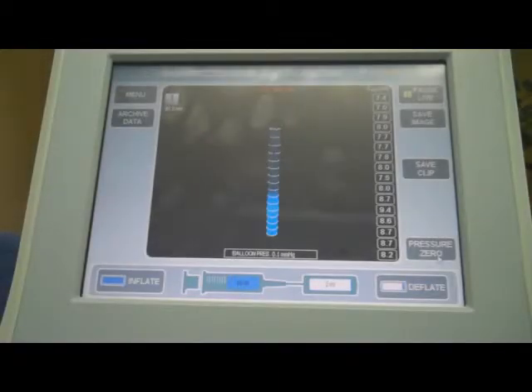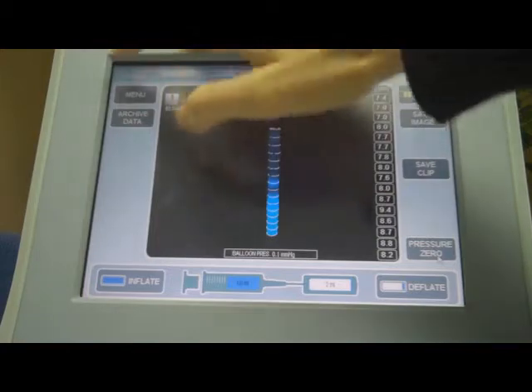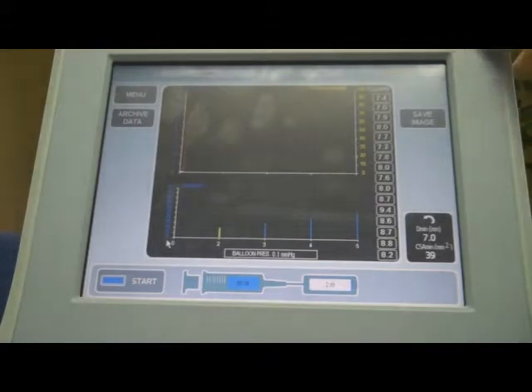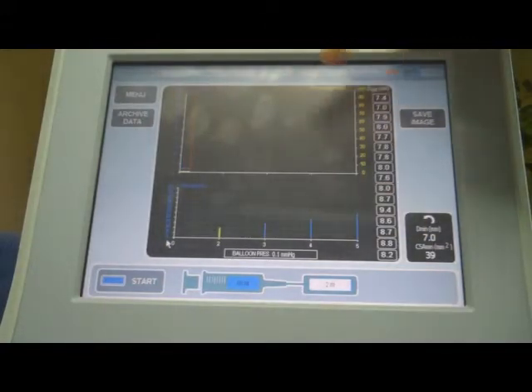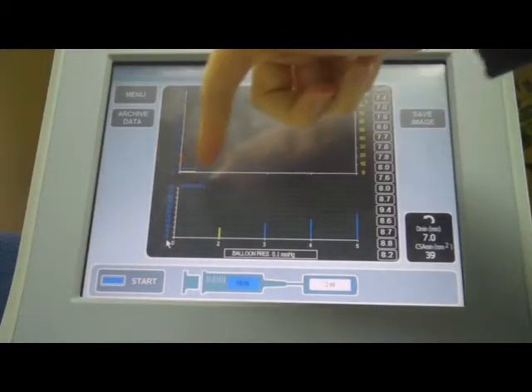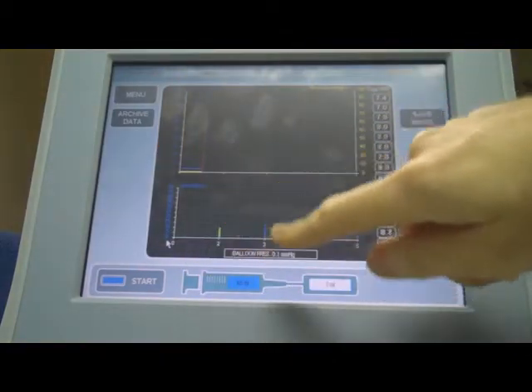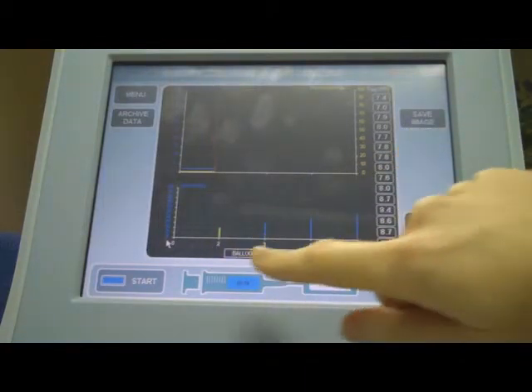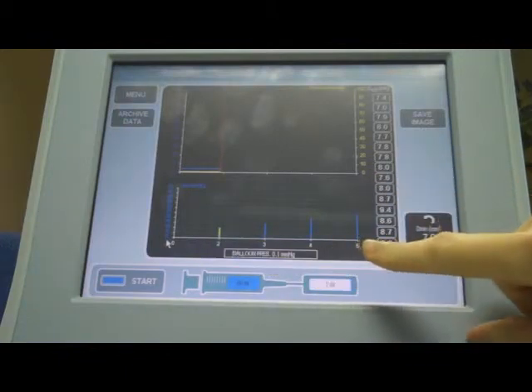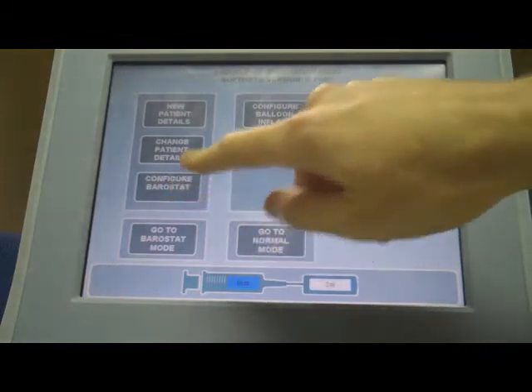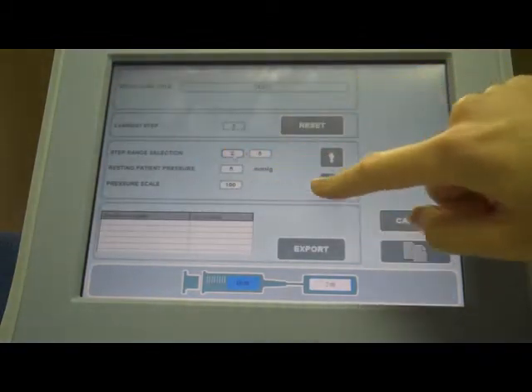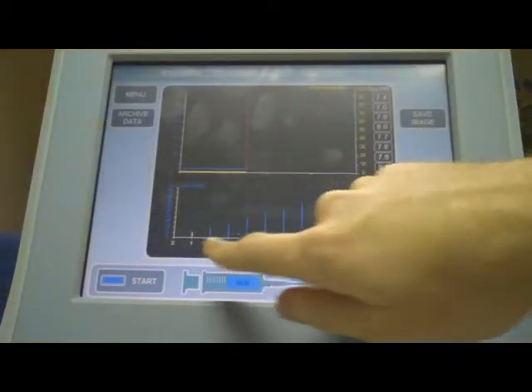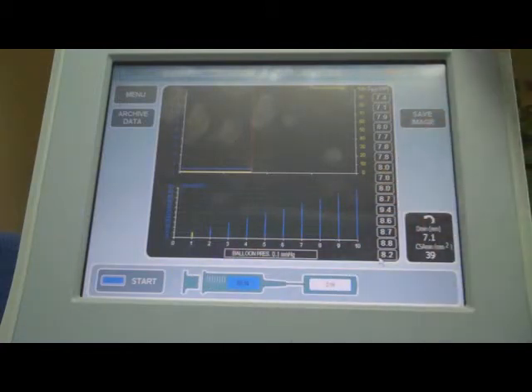Now that we've configured a Baristat procedure, we can execute one. To do so, press the menu button and then go to Baristat mode. This is now the Baristat mode screen. The graph at the top shows volume in blue and pressure in yellow, and the graph at the bottom shows the steps you're executing. Since we set the range to steps 2 to 5, you can see only steps 2, 3, 4, and 5. If we go back into settings and change it to 1 to 10 and save, you can now see steps 1 to 10 with the target volumes shown.